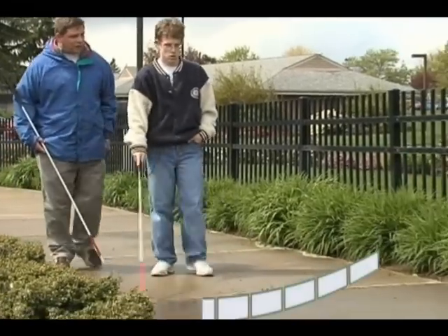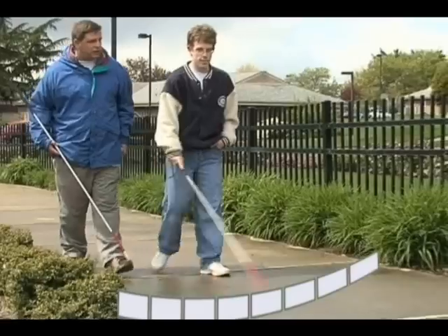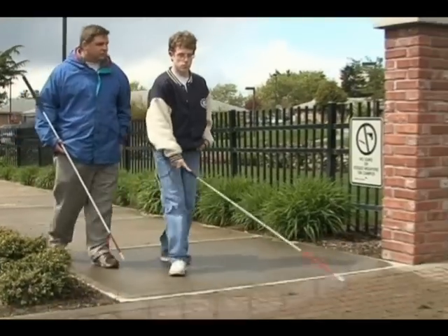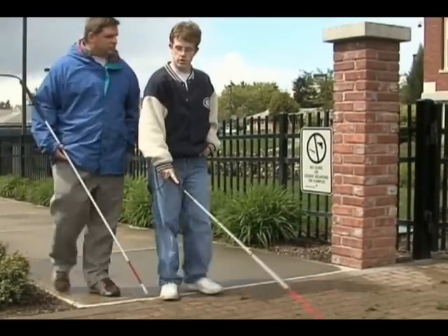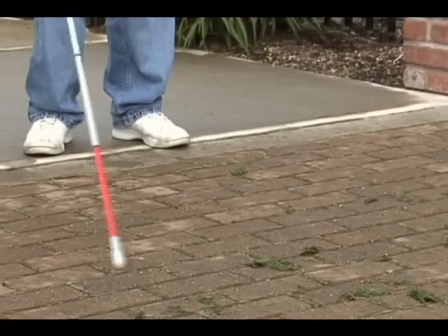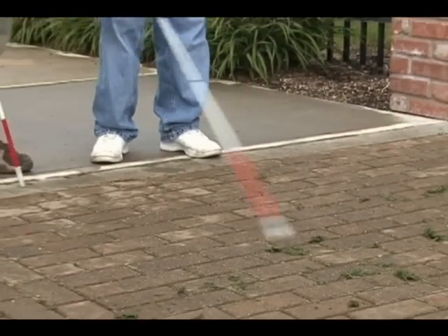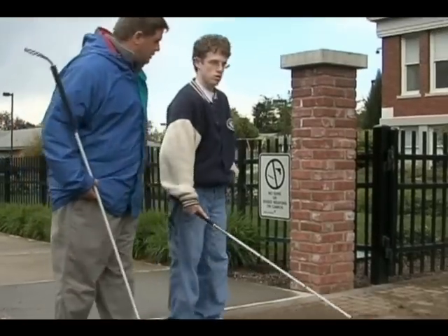So you're covering your whole body, shoulder to shoulder. Yes, I am — protecting yourself at all times. Oh, and here's a brick sidewalk. Does it feel any different? Yeah, it's a texture change, a brick sidewalk. Smoother or rougher? Rougher. Very good. Let's go inside the building.